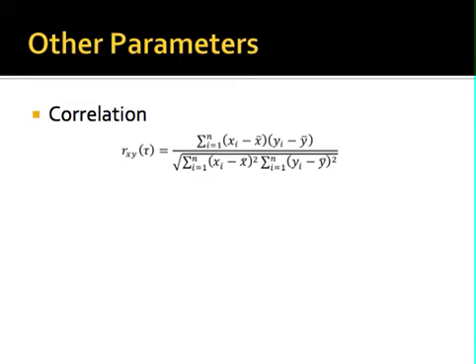So unlike frequency coherence, where you can take an average across the frequency band, wavelet coherence is just a little more complicated. You can certainly take an average of wavelet coherence across the scale. The problem is that what you gain from doing a wavelet is temporal resolution. And so obviously as soon as you average across the wavelet at a given scale, you have gotten rid of your temporal resolution. So you sort of defeated the whole purpose of using a wavelet. Maybe and maybe not, just depending on how you interpret it.